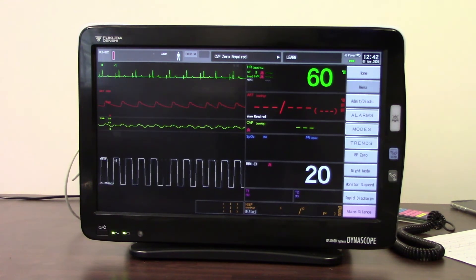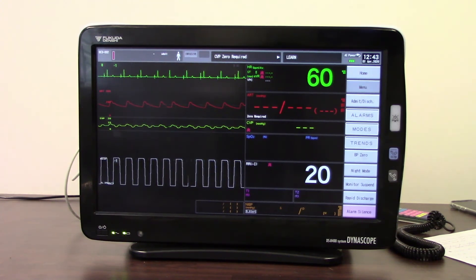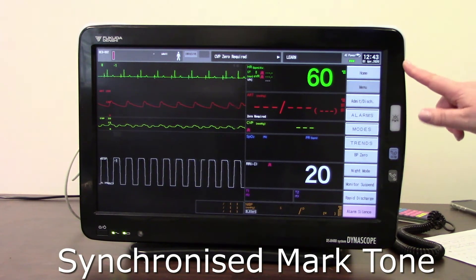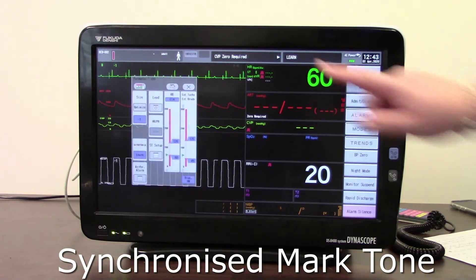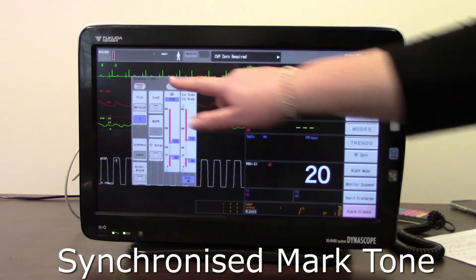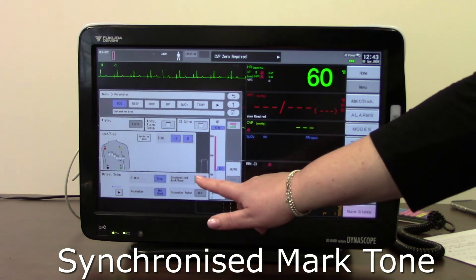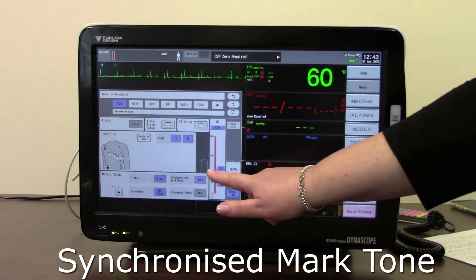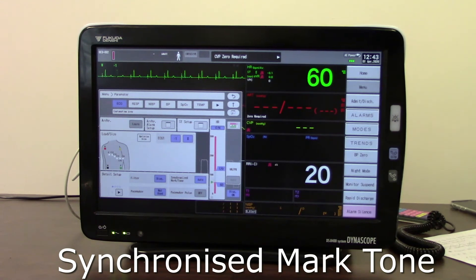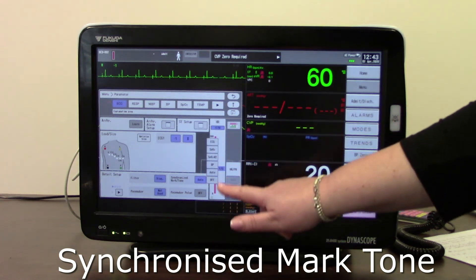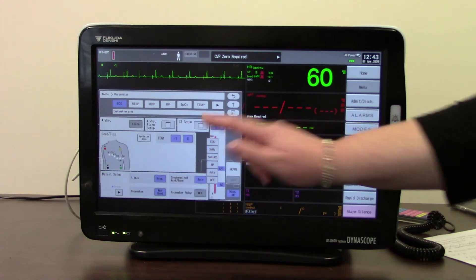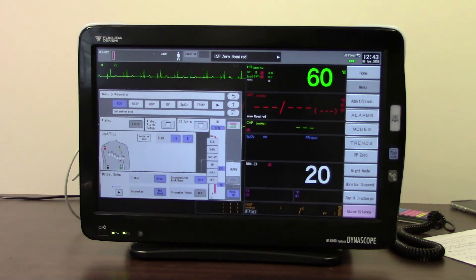The other button that may be useful is to turn on your synchronized mark tone — the beep-beep tone. You may want to have that turned on. Touch the heart rate parameter, go into the extended menu, and you can see your synchronized mark tone, which is currently off. If I switch that to auto, you can hear the beep-beep tone. You can also choose what source you want that tone to come from — oxygen sats, or you can turn it off entirely.